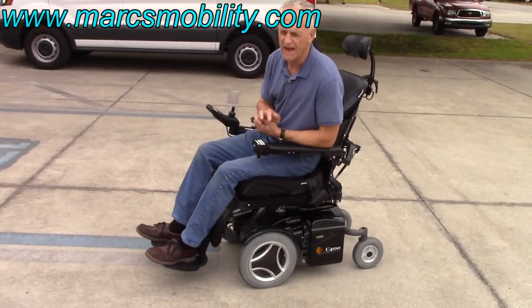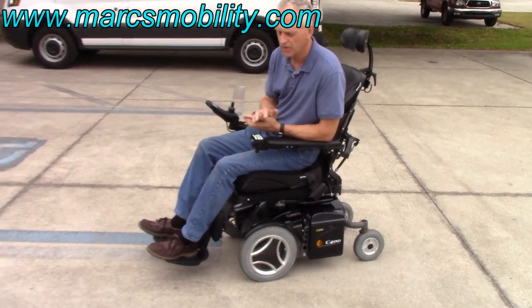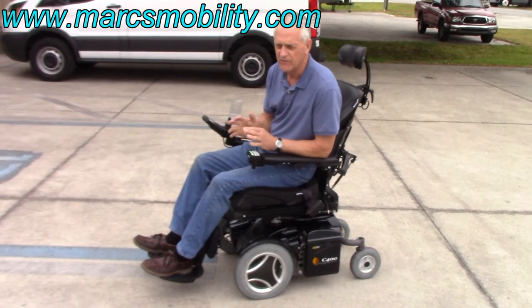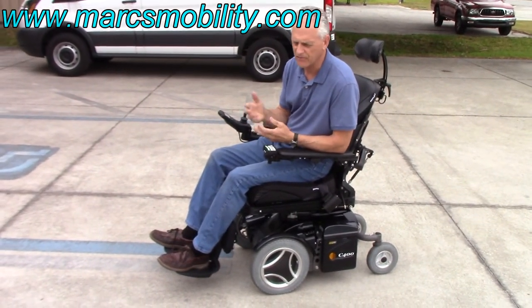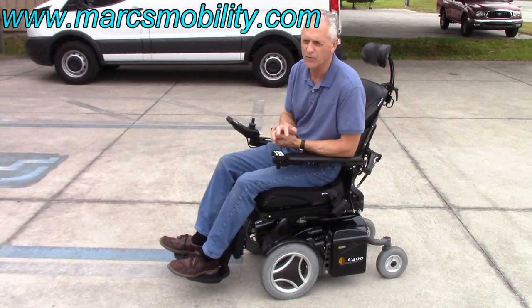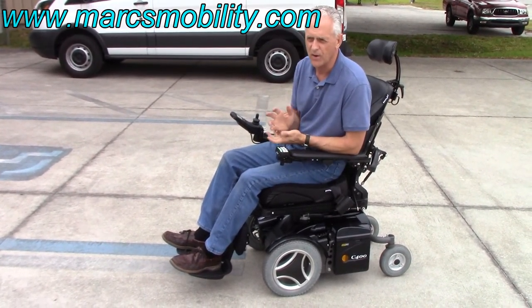So this chair goes 4.5 miles an hour, so it's not the fastest chair in the world, but it's built for comfort. It has everything on it — fully loaded, ready to go, great ride. No problem in the grass since it's a front-wheel drive, so it has great traction. 12 miles on this chair, so it's practically new.